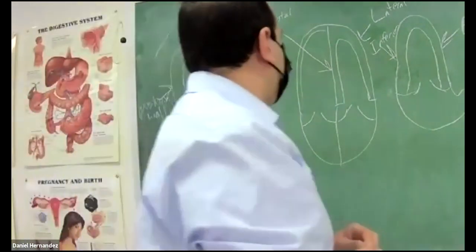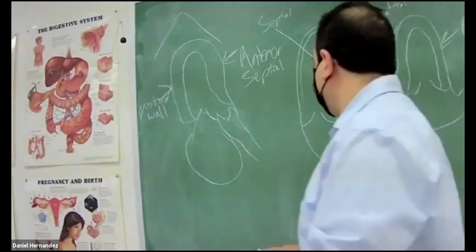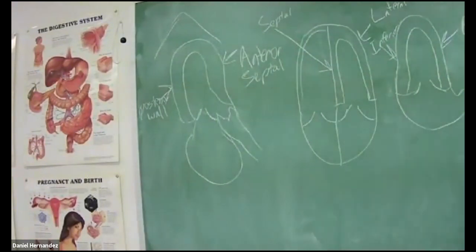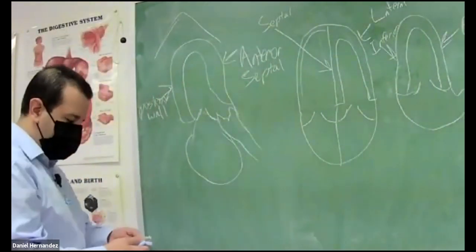So once you figure out what your walls are, then you have to go back in and color in your wall segments for the corresponding coronary arteries. I know for me, right before my registry, I drew all this stuff out and colored it in to really ingrain it in my head.